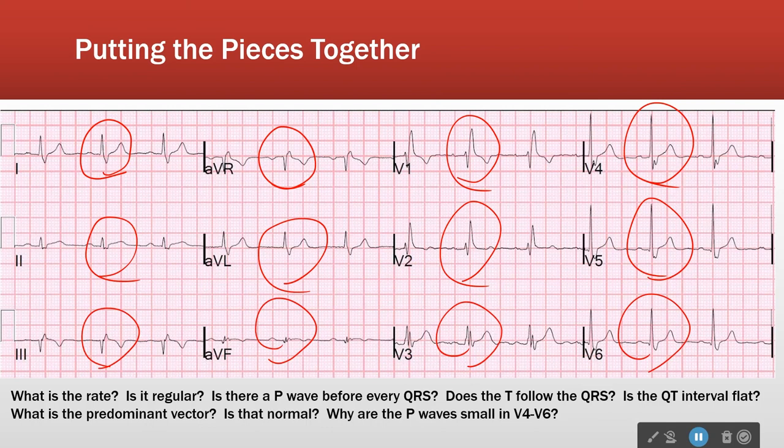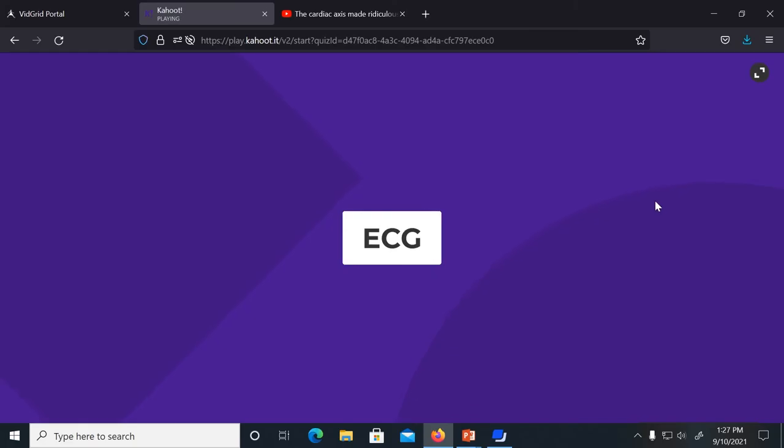And when we get you into reading EKGs, which is going to be in the spring, we'll give you some hints about which leads give you what information. But for now, know you get multiple pictures of the same heartbeats in this kind of table of tracings. All right, onward, here we go.